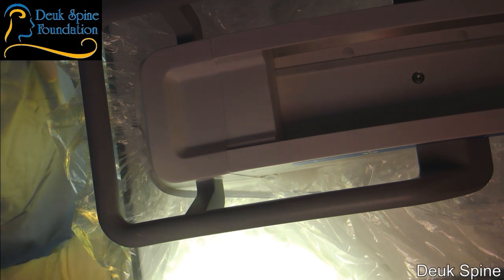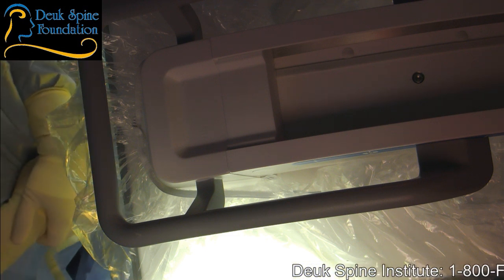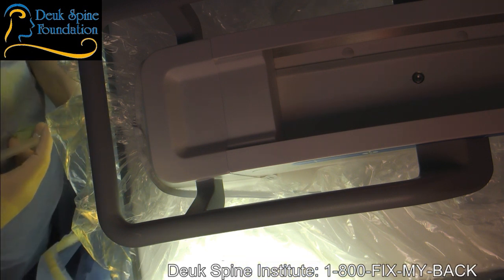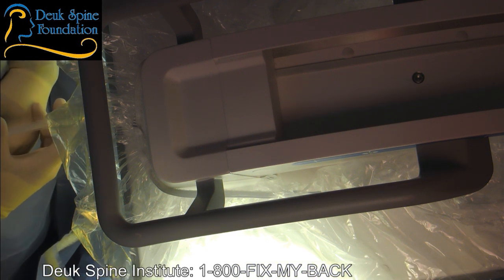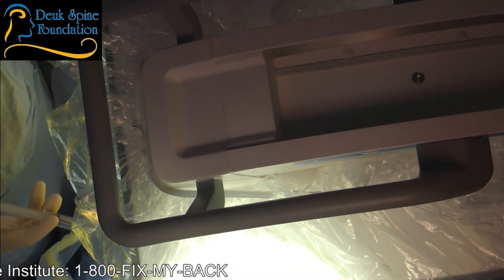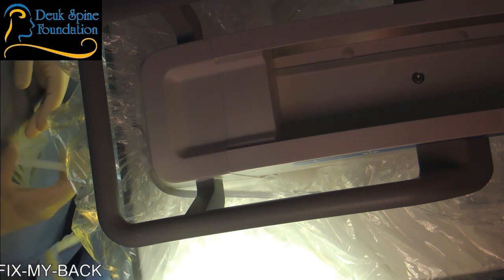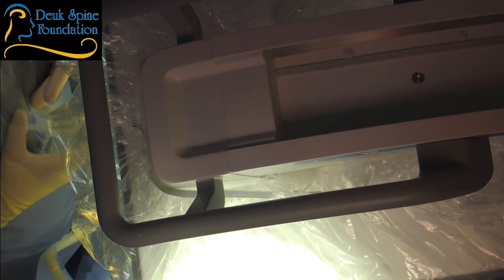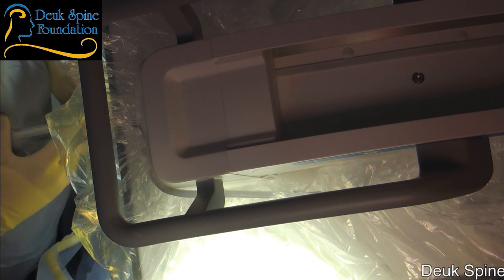Sir, you know the routine. You've watched a few of these surgeries, but you're going to be awake for the first, hopefully, just about 10 minutes, as long as I can get to where I need to go quickly. And then we're going to put you to sleep once we actually start the laser and endoscope part, okay? If you feel pain, just say, ouch. Don't move your body. Don't try to get away or move on the table. Just say, ouch, and I'll give you some more pain medicine, a little bit more local anesthetic, okay? Perfect. Anything else you want to tell them?